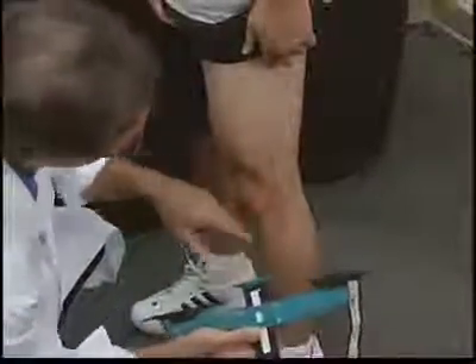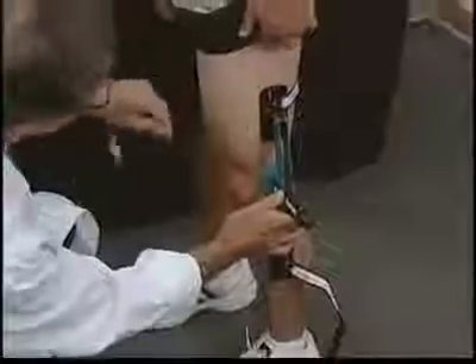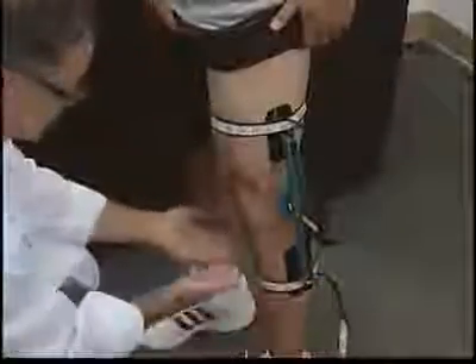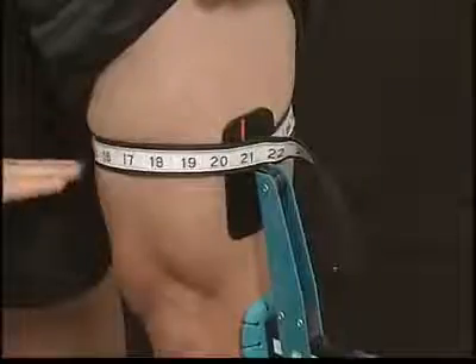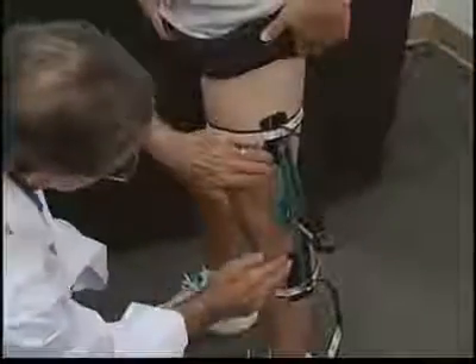Next, align the basket on the knee offset gauge with the impression mark left by the knee width gauge on the lateral side of the knee. Wrap the circumference tape around the thigh firmly, then do the same with the tape around the calf. Make sure both tapes are snug and parallel to the ground, and ensure that the two offset measurement paddles are flush to the leg.